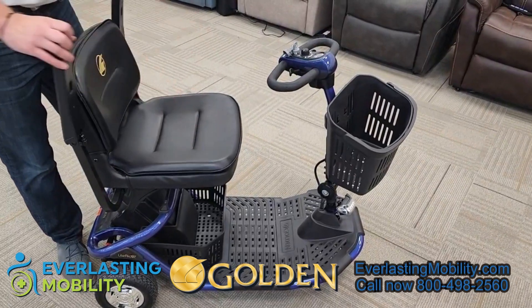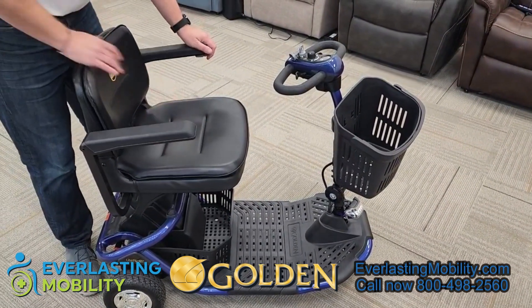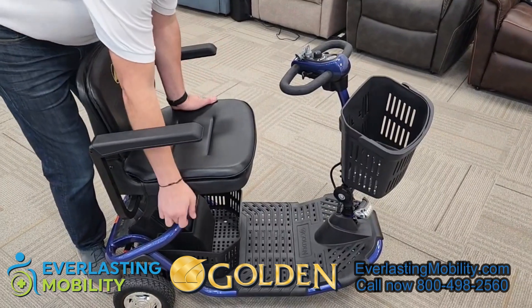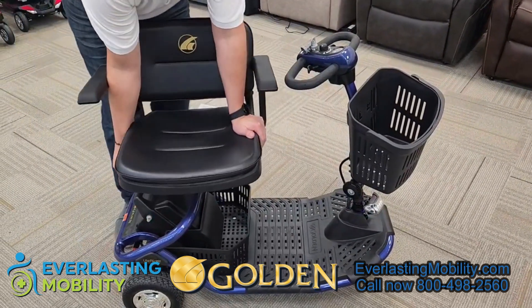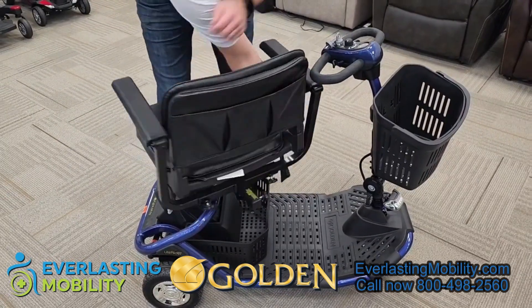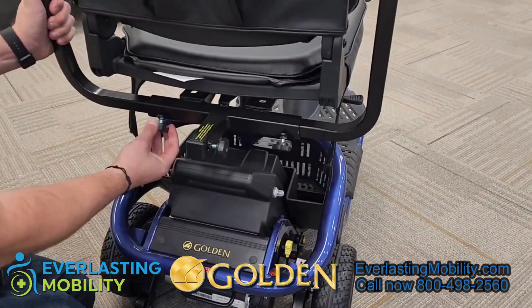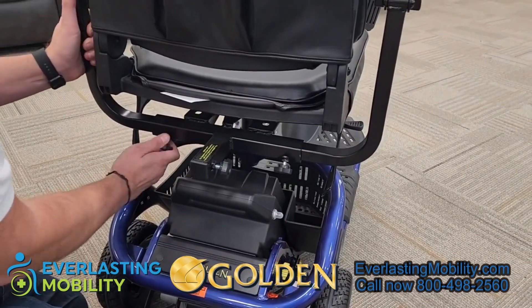The armrests do flip up on the scooter and you can put the seat down. There's also a storage pouch in the back. In addition, you can swivel the seat 360 degrees for easy entering or exiting. The armrests are width adjustable, and you can also remove them if you didn't want the armrests on the scooter.